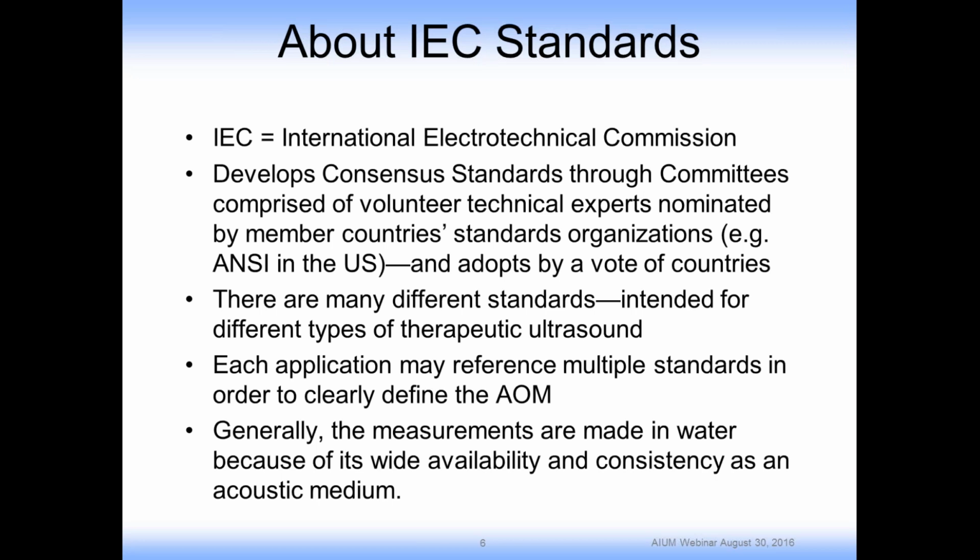There are many different standards for therapeutic ultrasound, and they're designed for different types of therapeutic ultrasound, and we'll be discussing that in a second. It's worth noting that each standard may reference multiple other standards in order to clearly define the acoustic output measurement. And it's also worth noting that generally the measurements are made in water because of water's wide availability and consistency of an acoustic medium. That isn't to say that other mediums couldn't become standardized in the future, but this is just what we have for most of these measurements today.